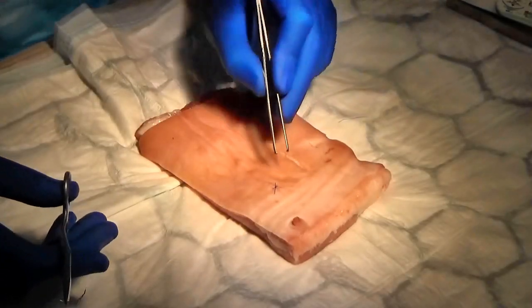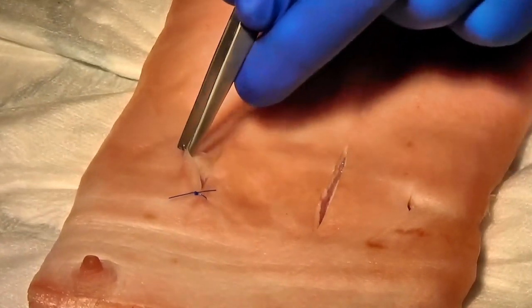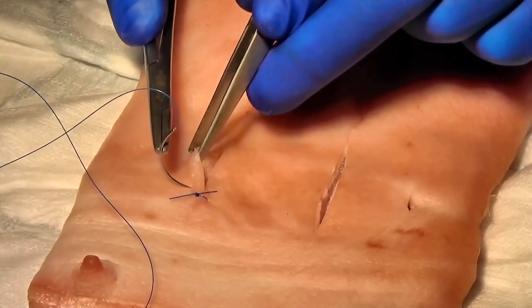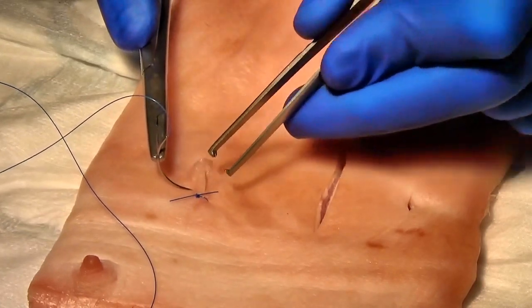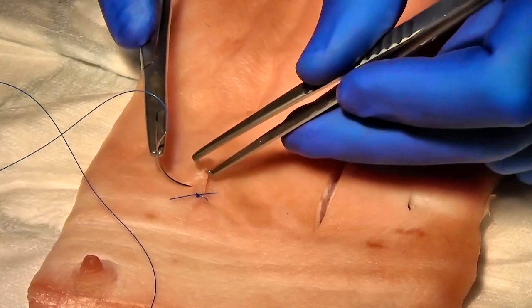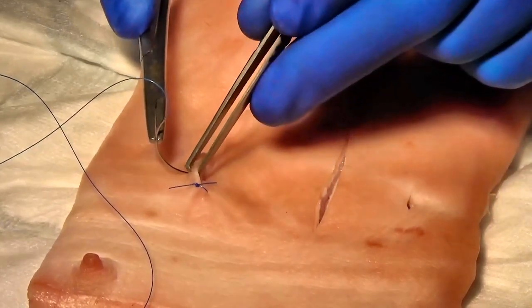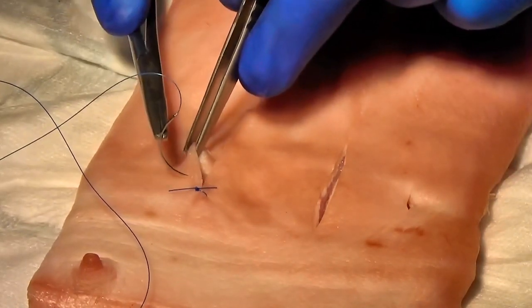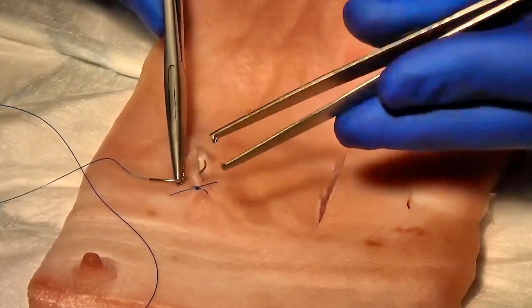So I'm going to show you a little bit more about suture placement. This is about 3-4 millimeters from the edge of the wound. Note, I'm not holding it right at the edge here. I'm holding it a little bit away so I can see the tissues there. And we'll just go through at 90 degrees.